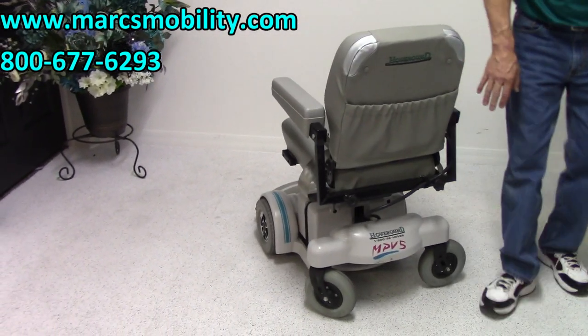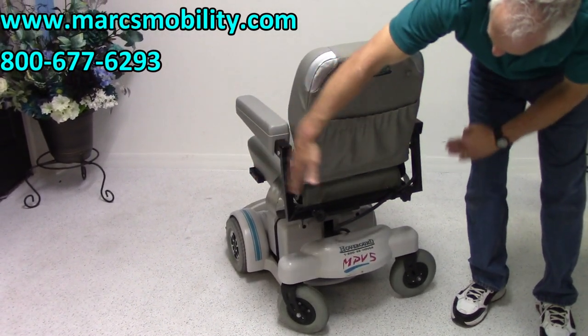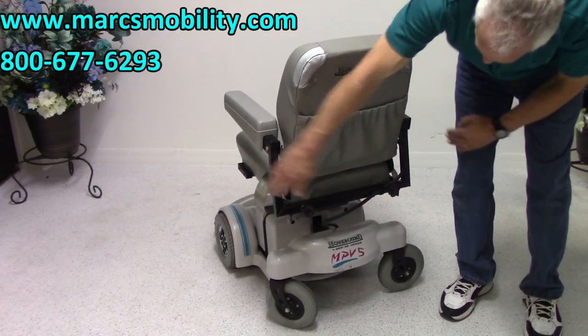At the back of the chair, you have a pouch for your manual. You have these knobs right here — that's how you extend the arms out. By releasing these knobs, you can extend the arms out.